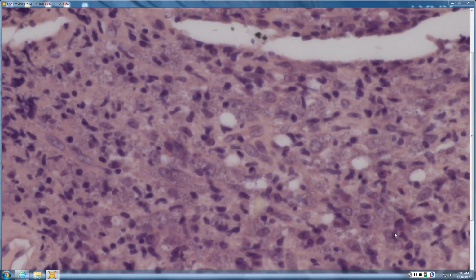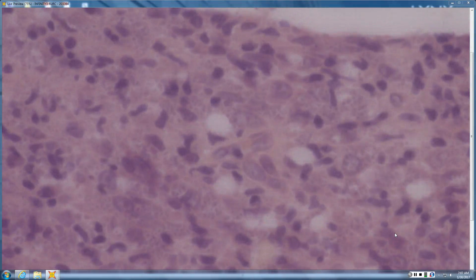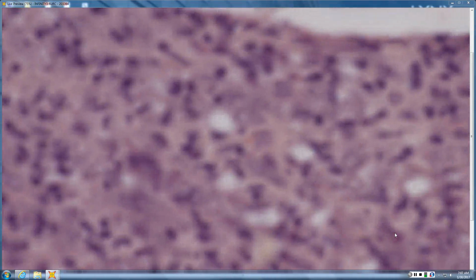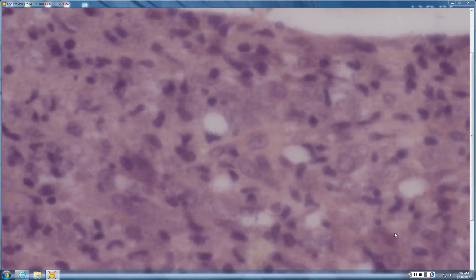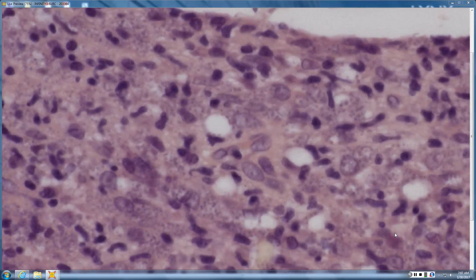So again, that can be helpful, but really when you just see all these super tiny organisms, you're thinking Leish, but you want to make sure it's not Histo and some other fungal organism. Of course, Leish is in the protozoan category. Some people say, well, you can try to look for the whole kinetoplast and stuff. That is very challenging, and sometimes it's better to do with stains, or easier to do with stains. But so that is Leishmaniasis.